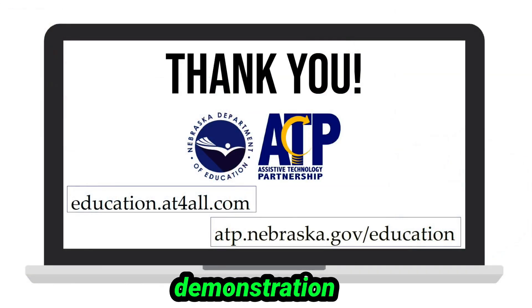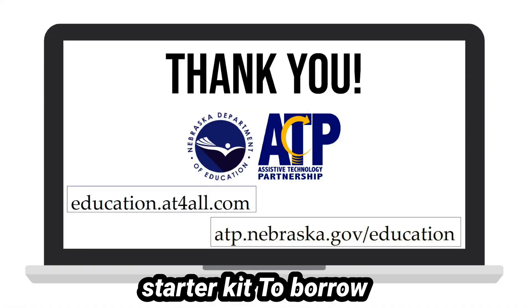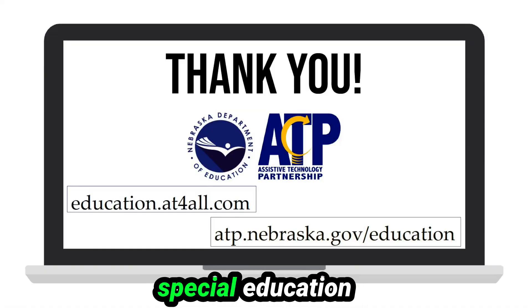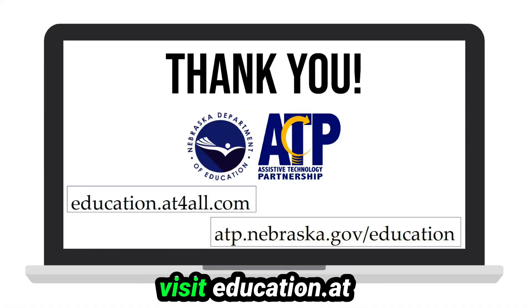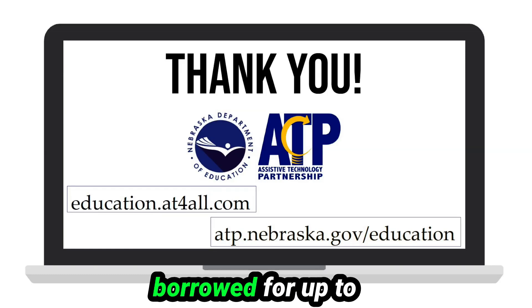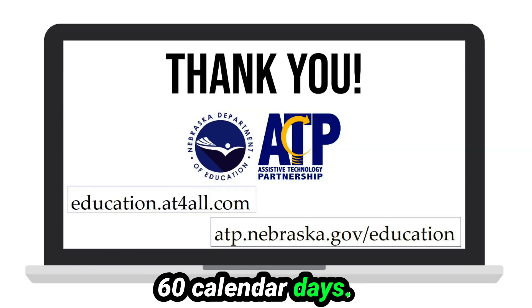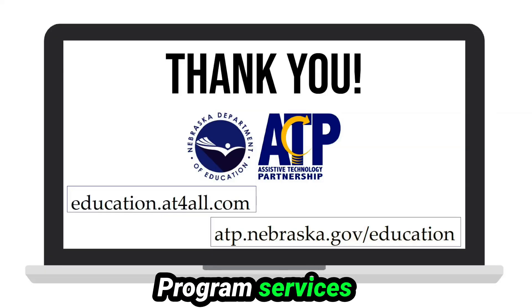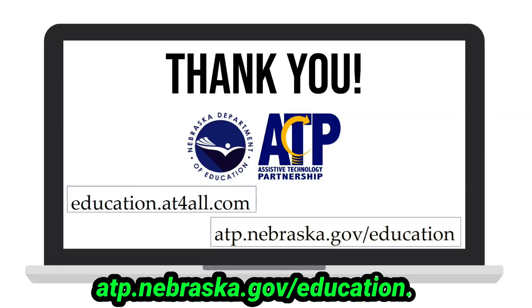Thank you for viewing this demonstration of the stabilizing silverware by Liftware Steady, specifically the starter kit. To borrow this device for free to try with your students receiving special education services, please visit education.at4all.com. Devices may be borrowed for up to 60 calendar days. For more information about the ATP education program, services, and support, please visit atp.nebraska.gov/education.